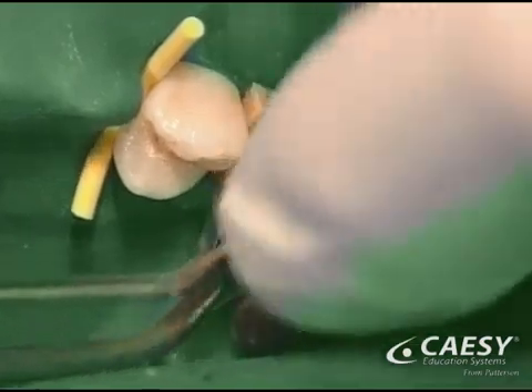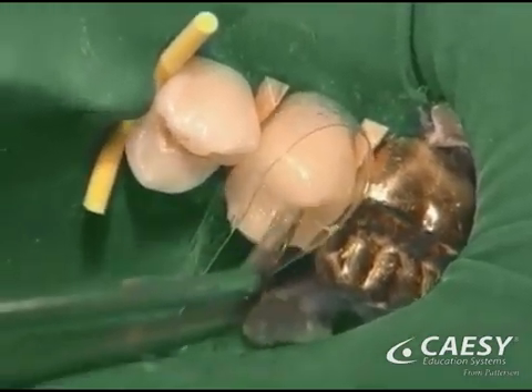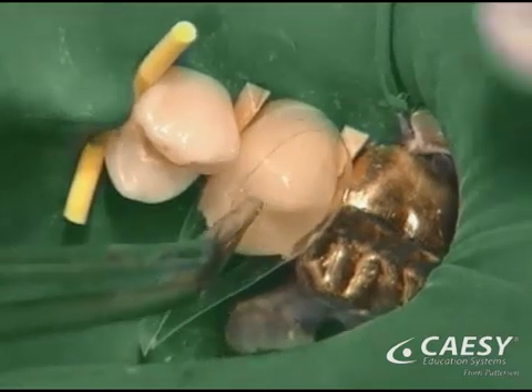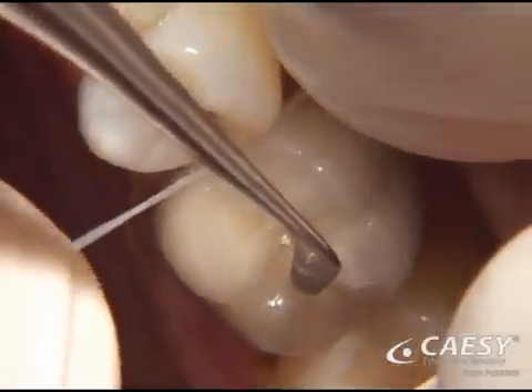We then try in the new restoration, add any custom coloring as needed, bond or cement it in place, and polish it to a beautiful luster. Last, we'll check your bite and make any final adjustments.